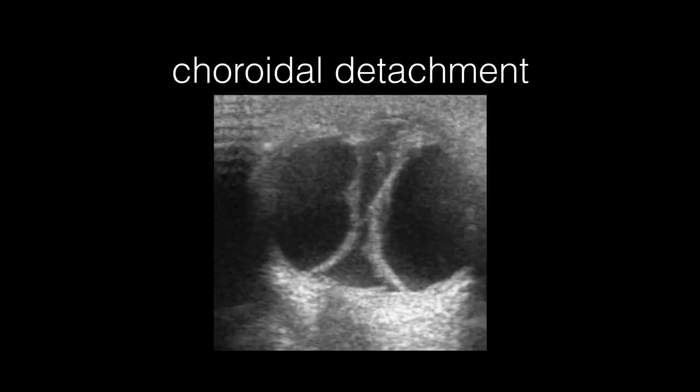So this is something I've never seen before. I've only read about it, but it's pretty clear if you would see it. This is called a choroidal detachment. This is usually something you'll see after a patient who had some ophthalmologic procedure done. This is blood underneath the choroid. If it's bilateral, you get this bilateral choroidal detachment. People call these kissing choroidals. Clearly, if you saw this, it's some pathology, and this is more for an ophthalmologist to manage, but if you saw this, you could describe it to them very clearly.